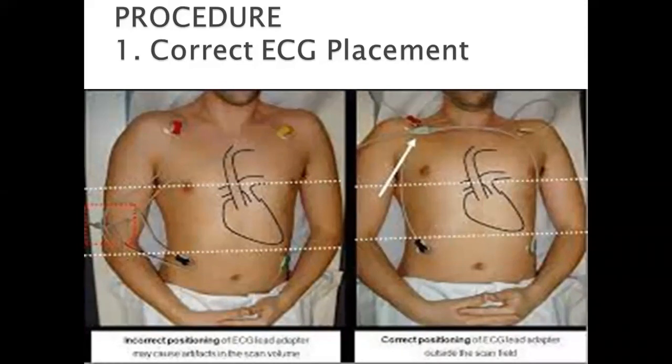You see that on my left side, the electrodes are put slightly too far below, where the clavicle is way above. That is not the correct way of putting it. Rather, like on my right side, it should be right below the clavicles, and inferiorly it should be subcostal, but in the same line as the axillary.